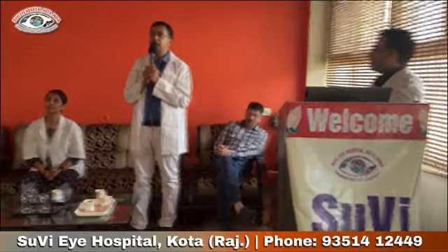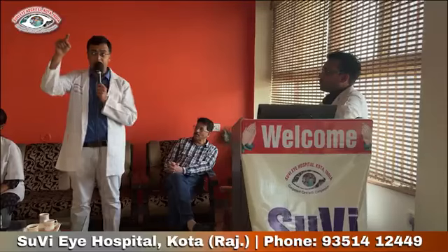PRP and barrage we discussed thoroughly. For horseshoe tears, they generally have subretinal fluid associated with them, at the edge of the horseshoe tear. The subretinal fluid will not take up the laser. So adjacent to the subretinal fluid, we do the laser, and we cover the horseshoe tear with 3 to 4 rows.